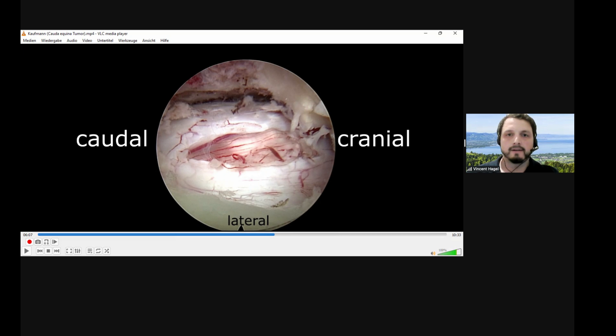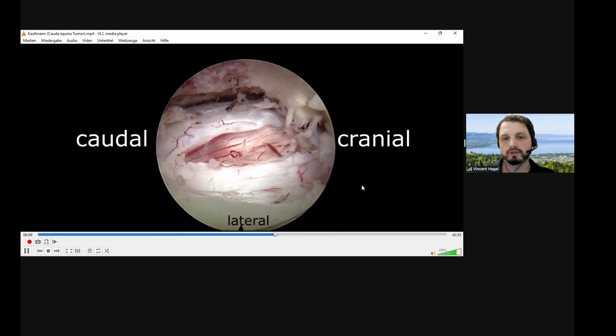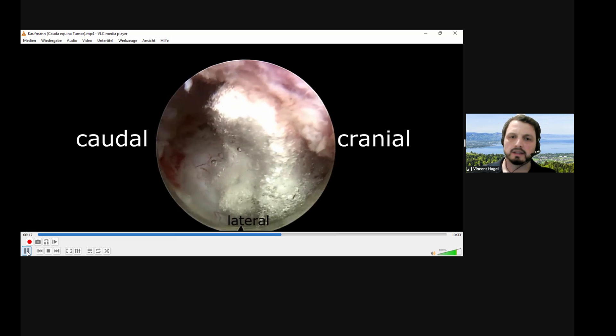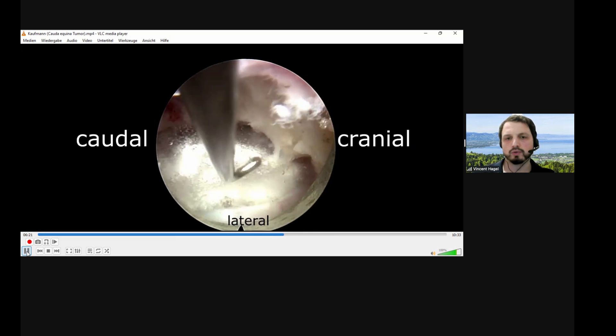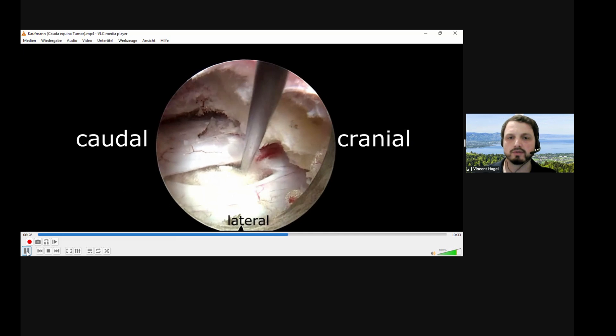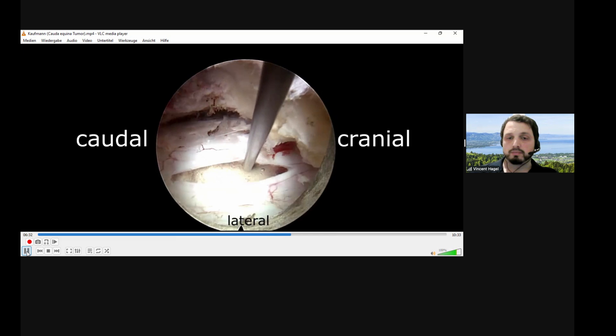This is from your case where you've already removed the intradural tumor and now you have to close the dura — and you're going to suture this. Right. Obviously this defect is too big to leave like this or put tacho seal on top of it. This is not sufficient to close it watertight, so at this stage I had to think about suturing the dura. As mentioned in the how I do it session about this intradural tumor, I would have been very disappointed to remove this tumor fully endoscopically and then have to convert to the microscope just to close the dura. So the first step is to place these fascicles back inside the dura and create a layer of protection before starting to suture.